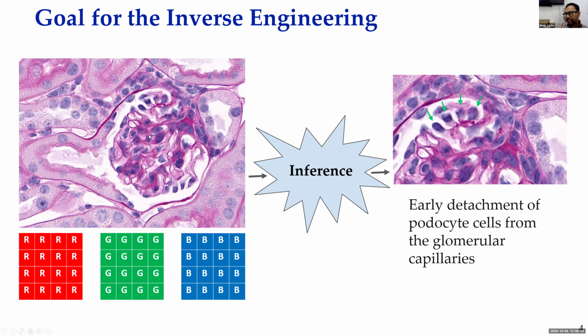For example, in this case, this is a kidney glomerulus image, where you can see these renal cells, podocytes. They are kind of perpendicular on top of the capillary. This is from a mouse which is moderately diabetic but has no sign of proteinuria or no symptoms, but it's still showing that change, right? So how can we infer that? This is the fundamental question, and in order to understand it, we take a very systematic approach.